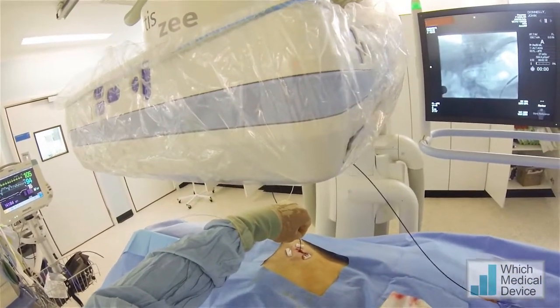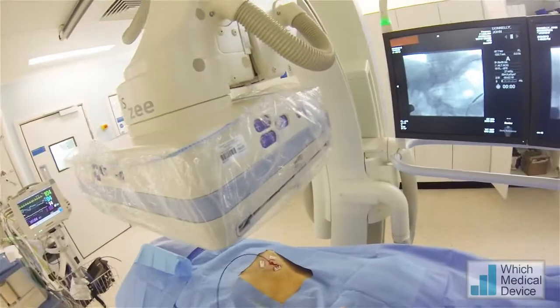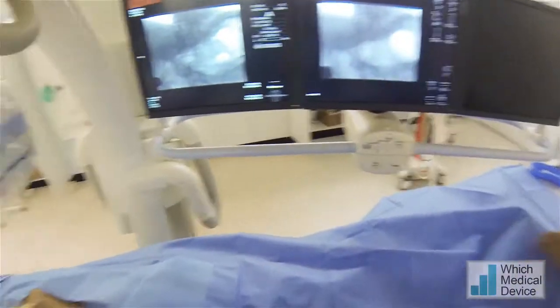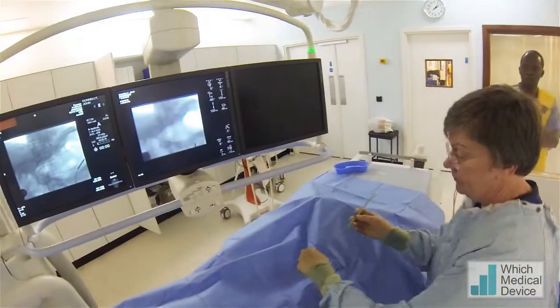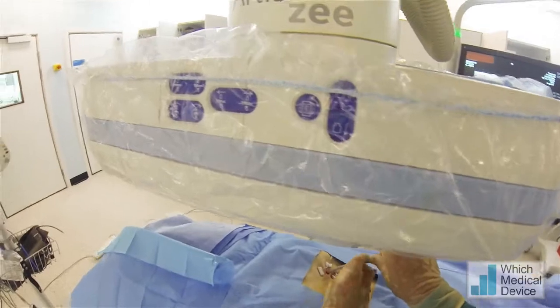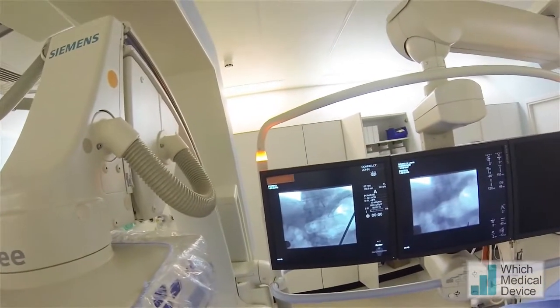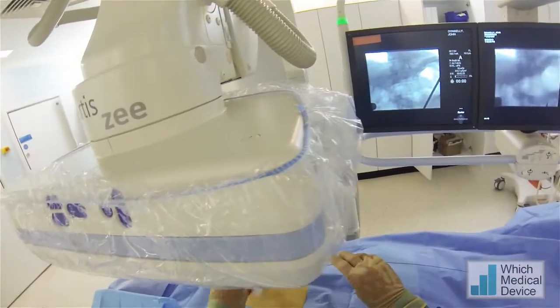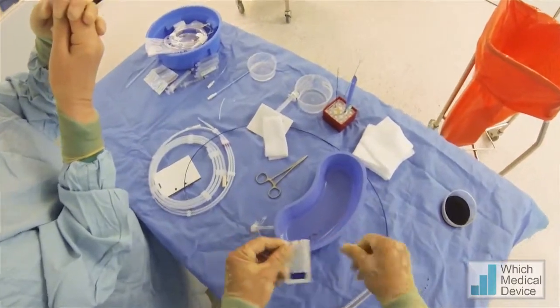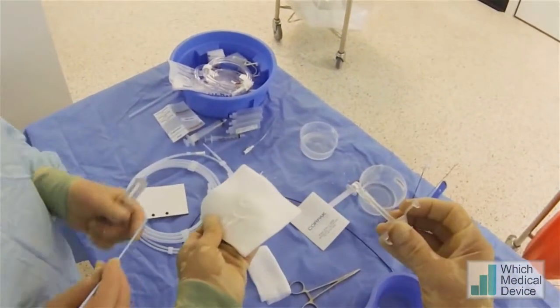Starting dilatation by inflating that 6mm balloon. We're then going to put in a 20 French dilator to allow us to insert the 16 French gastrostomy, which of course is larger than 16 French because of the balloon on the outside. Rotating as we go — and that's in position. Now preparing the gastrostomy tube: a bit of jelly on the outside of the tube and a little bit of jelly on the dilator.